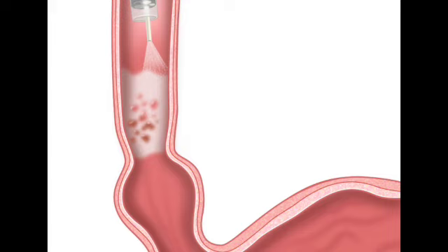So there is no long-term damage. Right. No burning through the stomach lining, no permanent scarring from the acid. None. Just some mild temporary inflammation that you would probably get anyway if you ate a particularly acidic or spicy meal. Exactly. The concentration of the acetic acid used in that 20 cc syringe is carefully calibrated. That makes sense. It is strong enough to trigger the temporary protein shift on the surface of the cells, but weak enough that the biological footprint on the patient is incredibly light. The healthy tissue recovers its normal state shortly after the procedure.